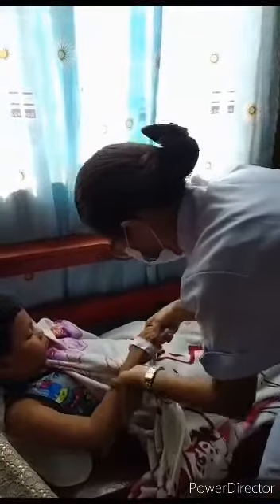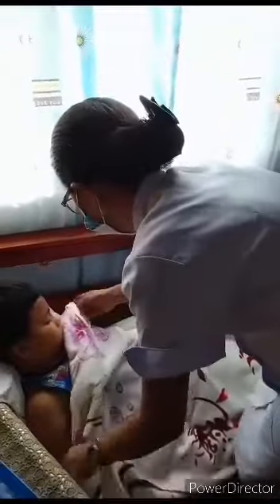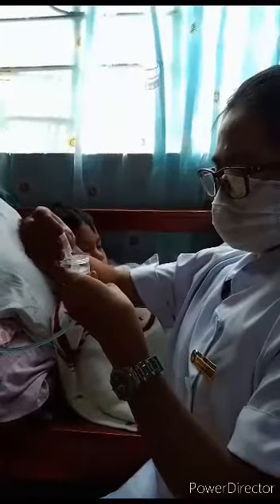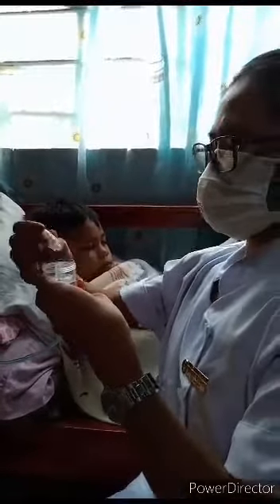Step number 5. Identify the patient by checking the name and identification on the patient's identification band, or ask the patient to state his or her name. Identifying the patient ensures the right patient receives the medication and helps prevent errors. Step number 6. Explain the procedure to the patient to gain cooperation and to allay anxiety. Step number 7. Fill the nebulizer cup with the ordered amount of medication. This ensures that the required medication amount is given.